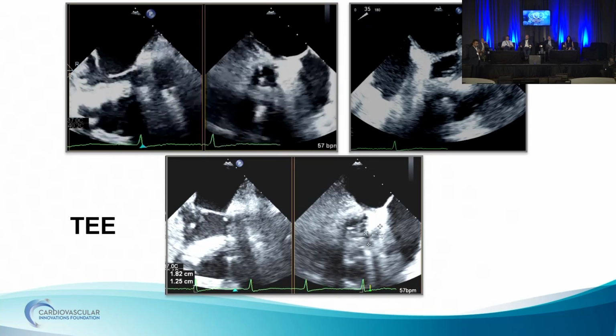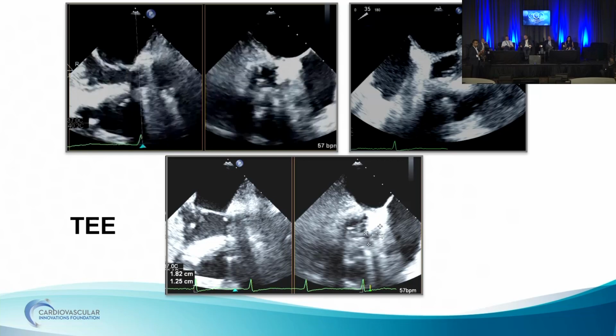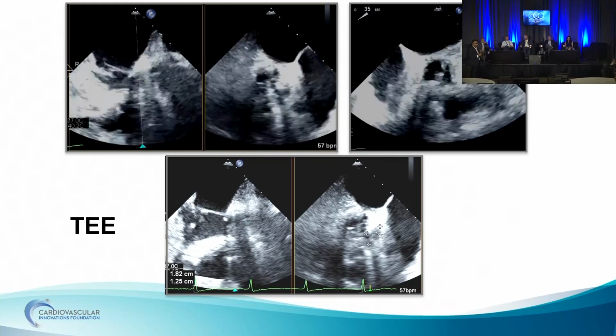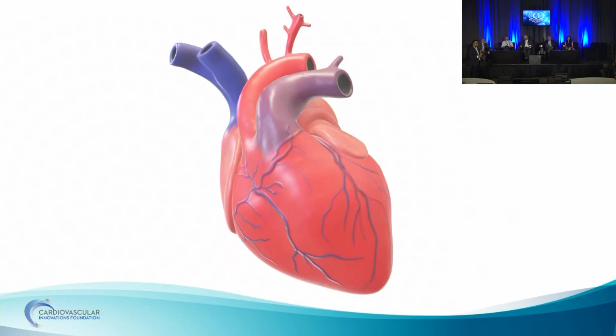So again, the transesophageal echo wasn't done during the procedure. This was just on previous difficult imaging. As you can imagine, below the LVOT there's going to be quite a bit of shadowing, and it wasn't as much used from a peri-procedural perspective.